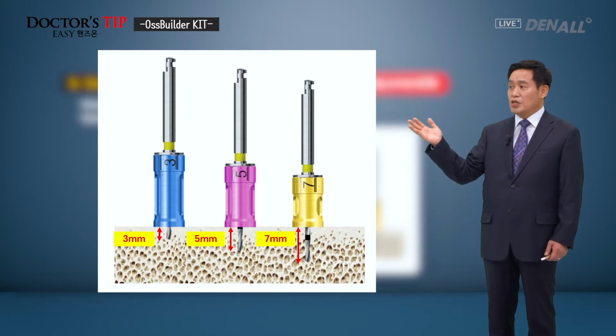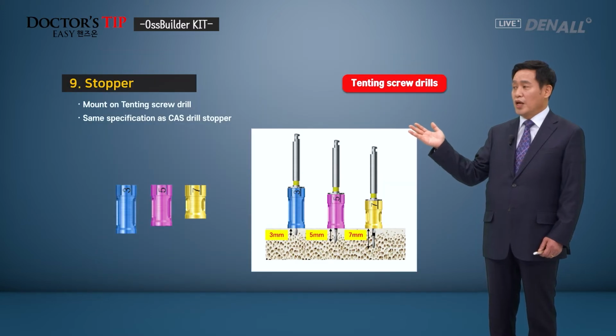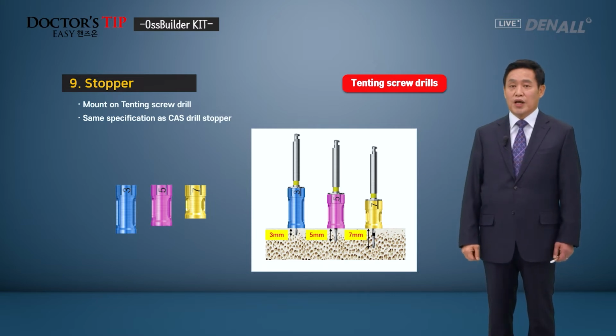If you use the blue, the 3mm, you go in 3mm. The purple, 5mm, you go in 5mm. And for yellow, you go in 7mm. You can choose the drill length using the stopper, and you'll be able to control that. When you fix the tenting screw, the depth can be adjusted using the stopper. So it's very easy to use.